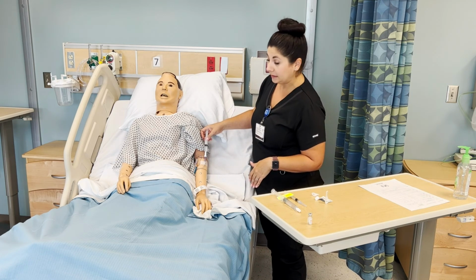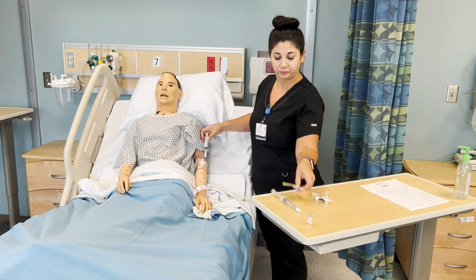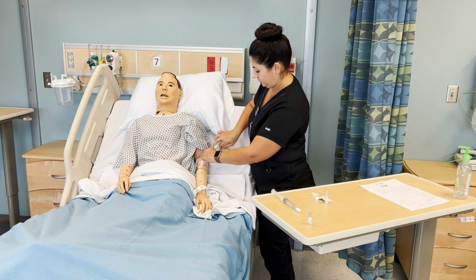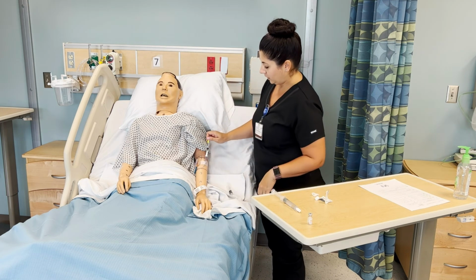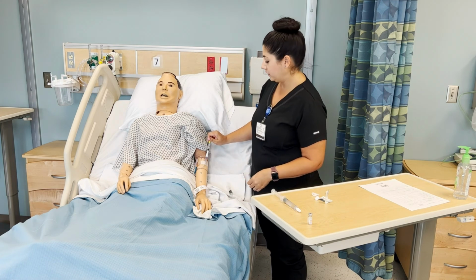You'll push at least 3 milliliters at a slow rate. You will then switch to your medication syringe, pushing the medication at the appropriate rate determined by your drug cards or the med book.